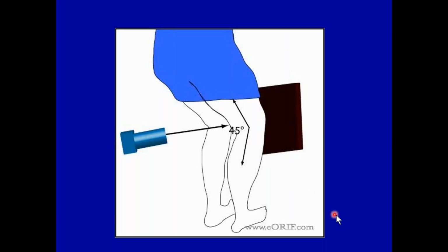And this is sort of coming from the orthopedist group. If you go to this particular website, they will talk about it. Someone has come up with that view. It's an alternate view when you can't tilt your tube.